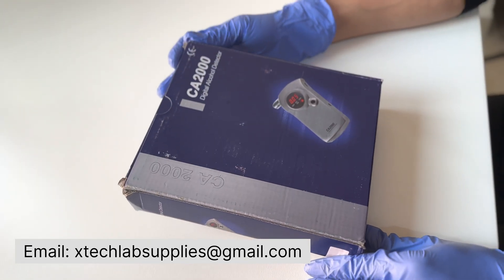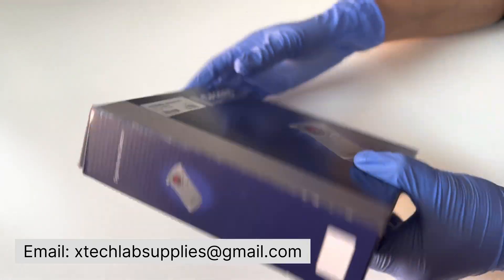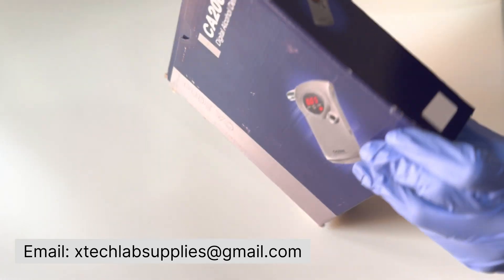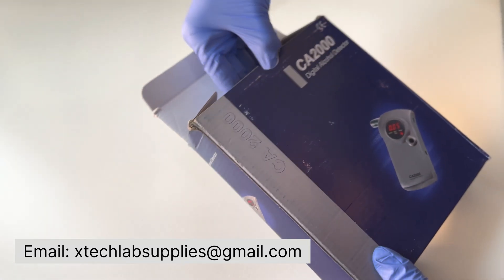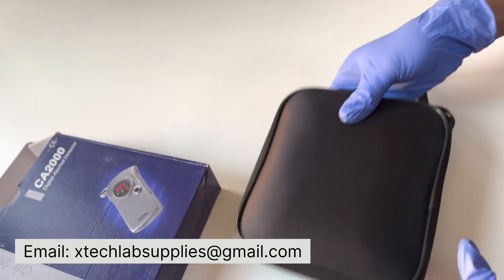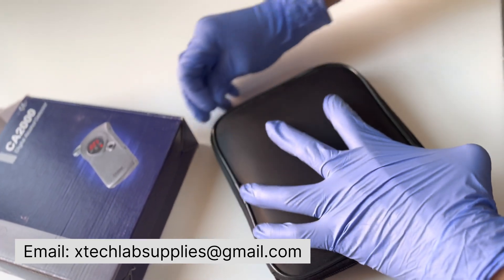This is the outer blue box. The model number is CA 2000. When we open it, we find a black case. When not in use, you can keep the instrument back in the case.